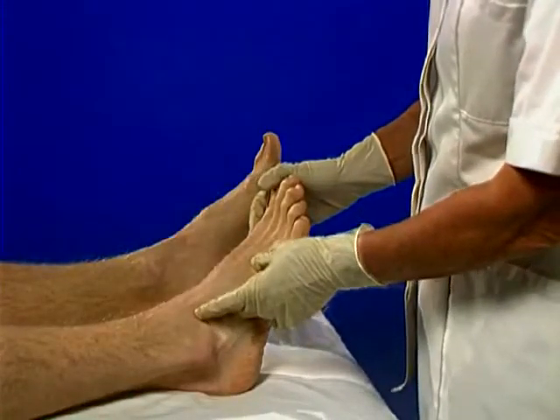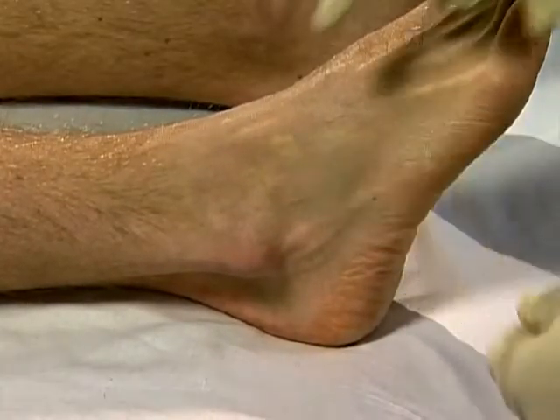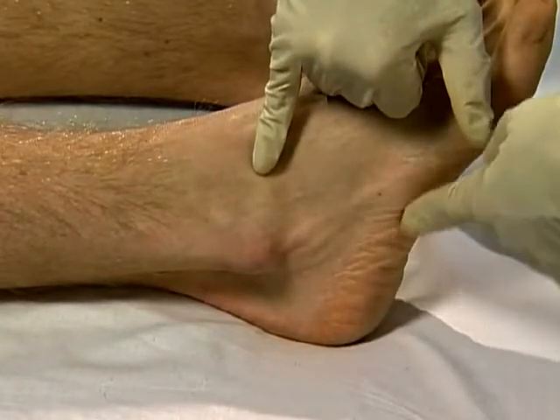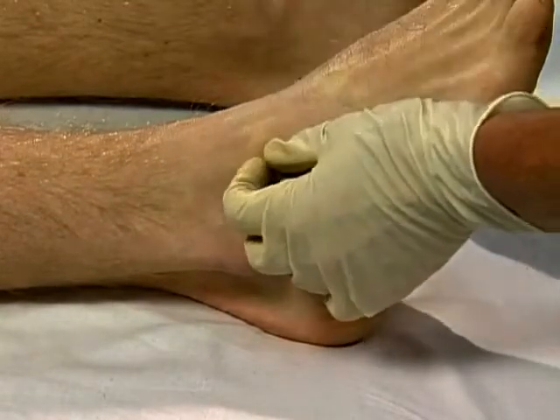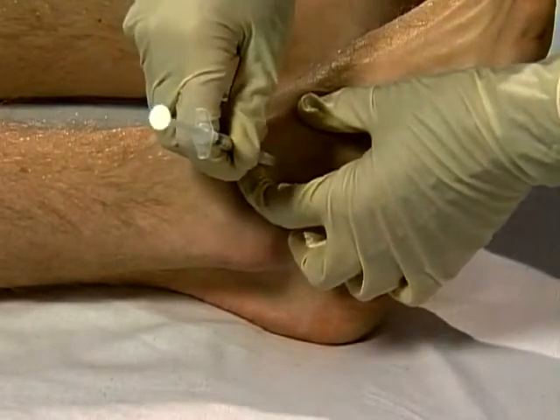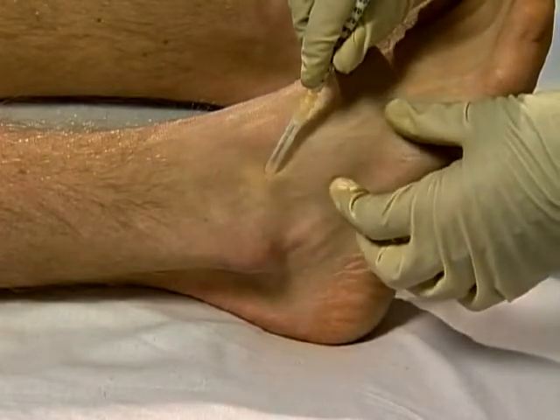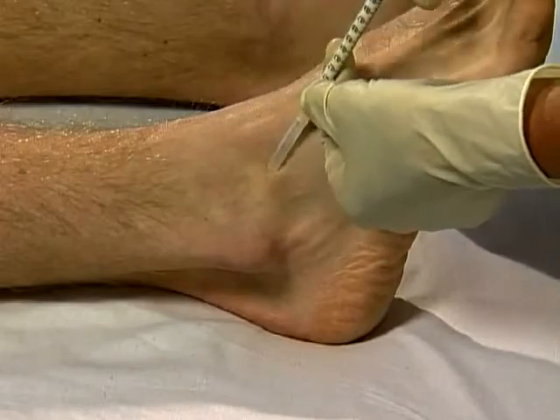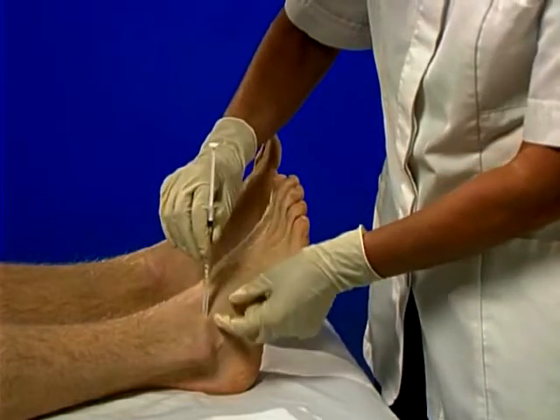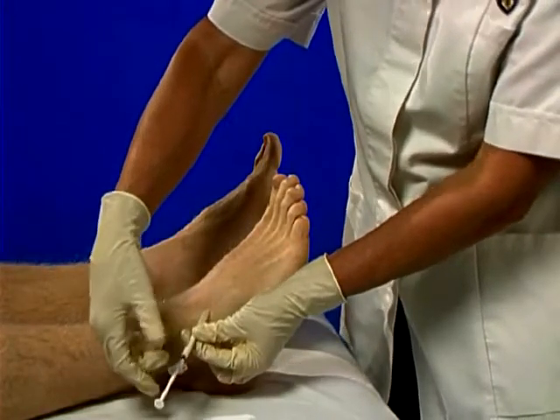The ligament runs from the antero-inferior aspect of the lateral malleolus to the top of the talus. It is approximately the width of the little finger and runs parallel to the sole of the foot. Mark the entry point at the centre of the ligament, clean and firmly stretch skin, and rapidly insert needle perpendicularly. Angle upwards to gently touch bone of the lateral malleolus. Aspirate and pepper half the solution along the malleolus, then turn needle subcutaneously down towards the talus, gently touching bone, and pepper the remaining fluid here.